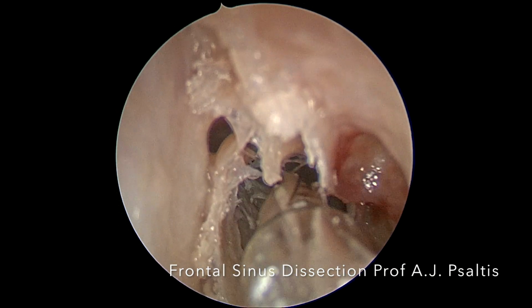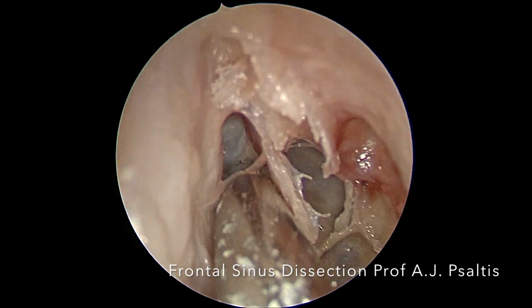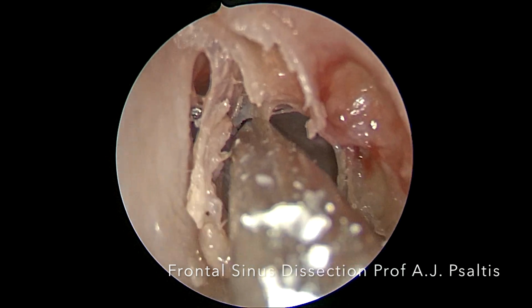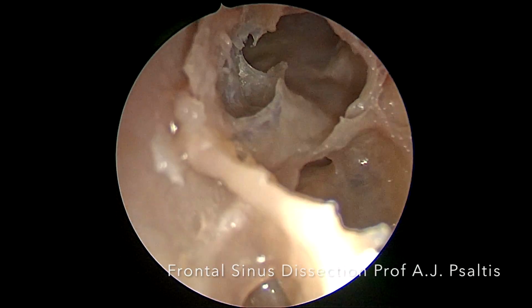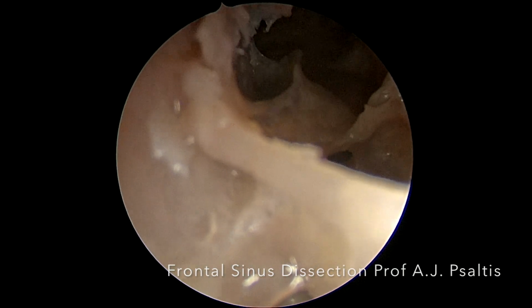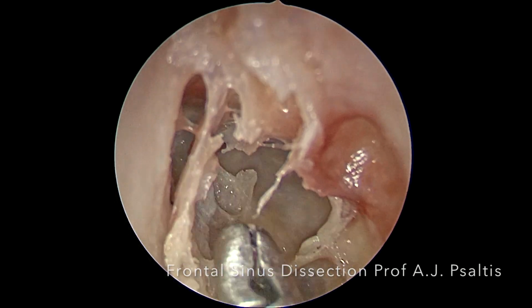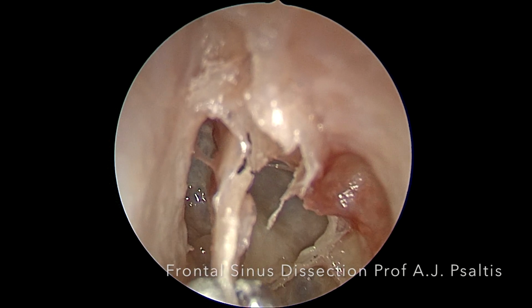Using the microdebrider or a curette, we now fracture the medial wall of that intersinus septal cell, loosening this medial barrier, and this will allow further enlargement of the frontal sinus ostium. Using a giraffe forceps, we can then remove this partition and the small fragments of cells behind it.